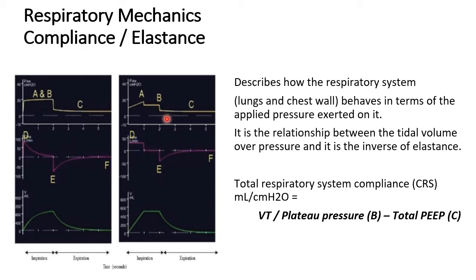And the calculation will be the tidal volume over the plateau pressure minus the total PEEP. And the reason you have to also do an expiratory pause maneuver is to calculate the total PEEP, as we will talk about.